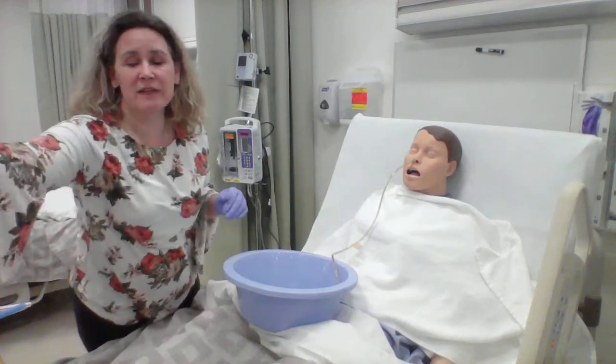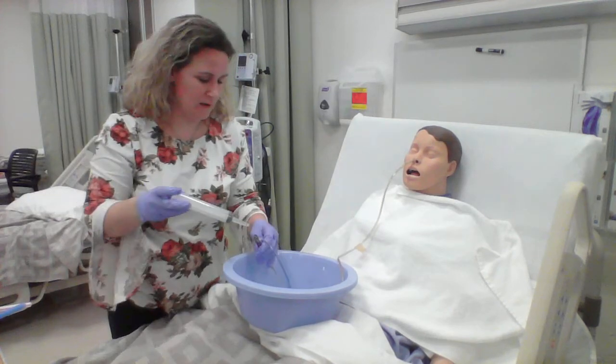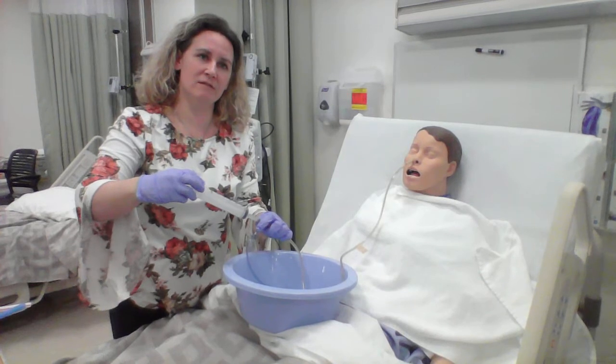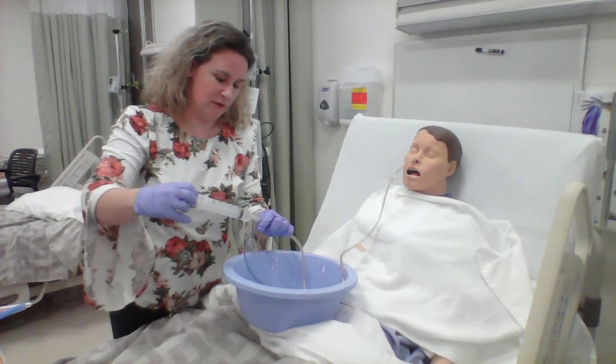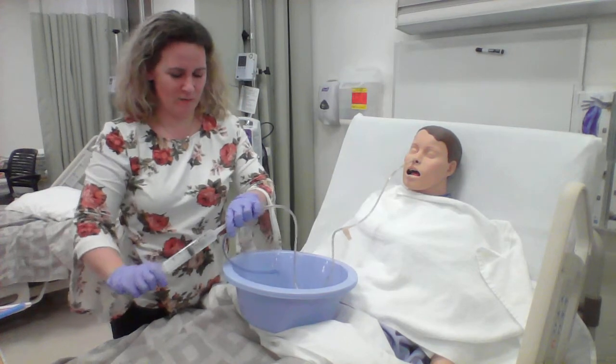And while it's in place, I'm going to go ahead and test the pH of the stomach. So I'm going to pull back 5 to 10 mLs.